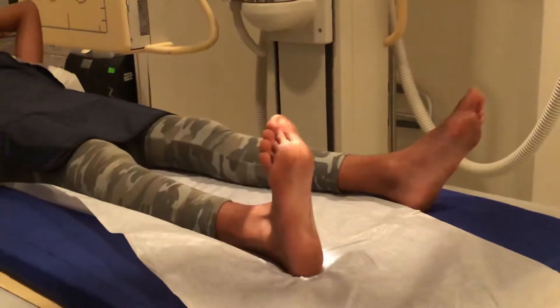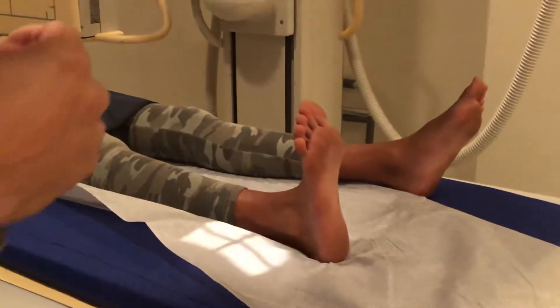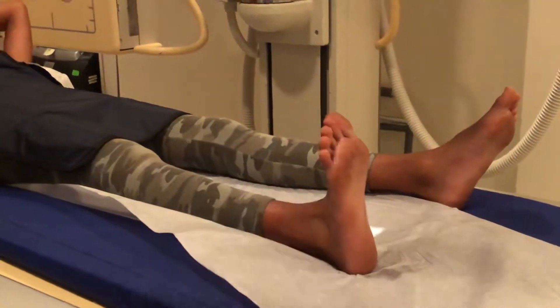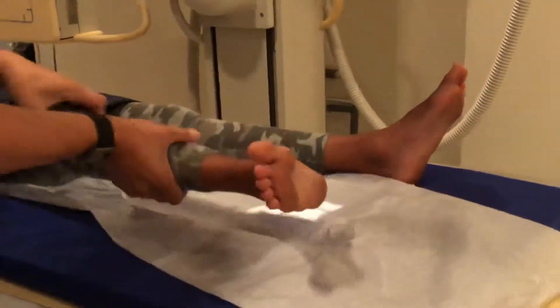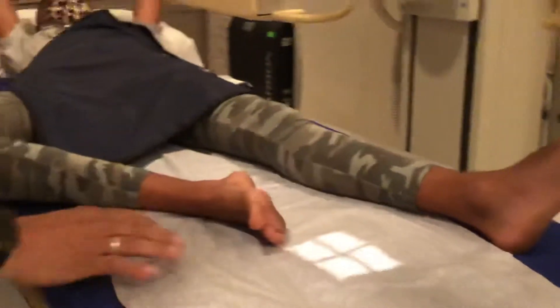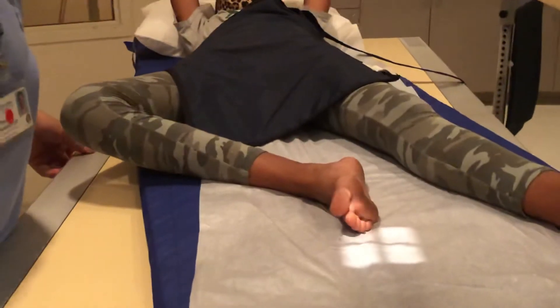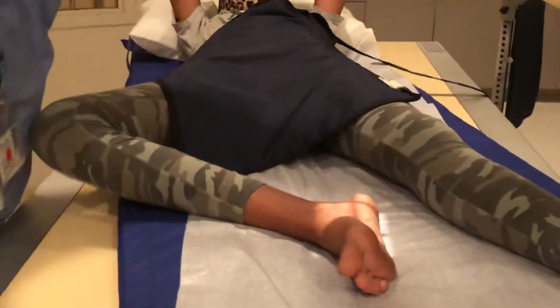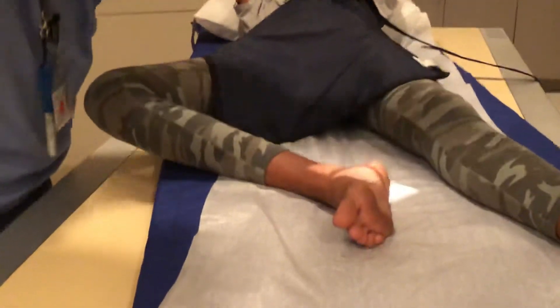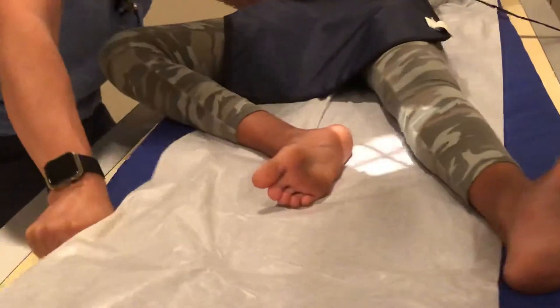The second and last view is going to be a lateral, and the way we do the lateral here is the same way we do the lateral for the foot and the ankle. So we're just going to turn the patient this way. I find it's much easier to move the mattress than it is to try to explain to the patient how they should move, since most of them haven't done the exam before. It's very easy to move everything around so you can get it to line up to look nice.